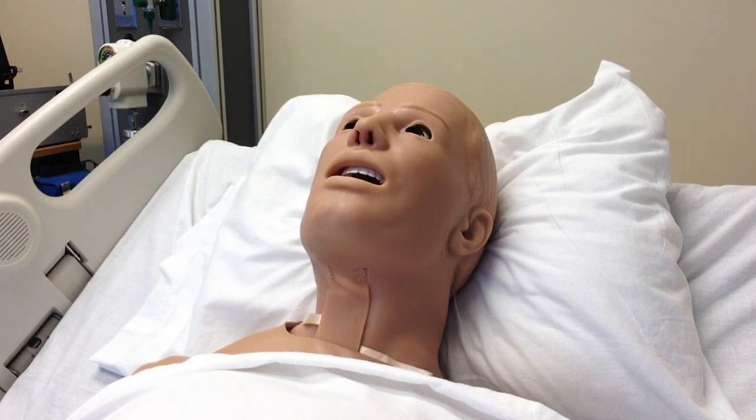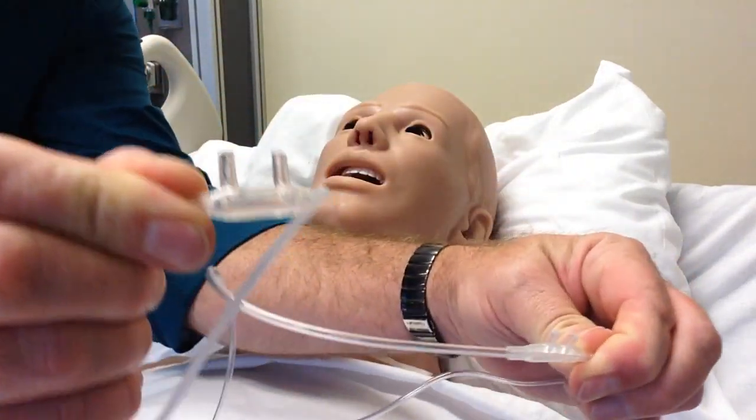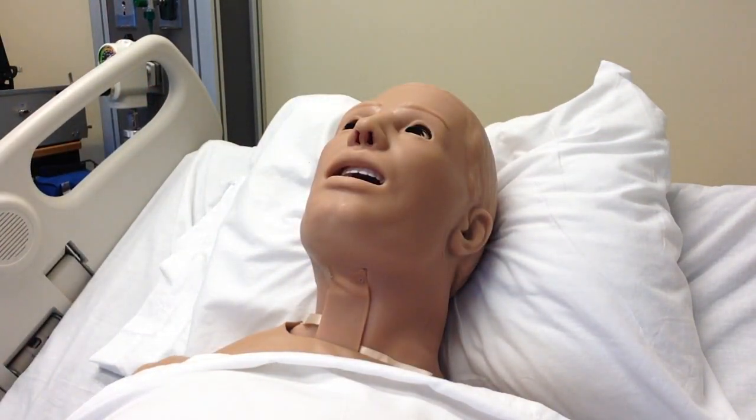When you get into neonates, you will find out that you can give less than 1 liter per minute at a certain FiO2 because you'll be giving this off of a blender. For our purposes, we will be dealing only with adults. So you can see a difference. This is an adult size, that's an infant or pediatric size. So for ours, we will be doing an adult only.